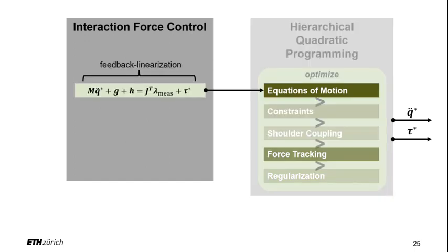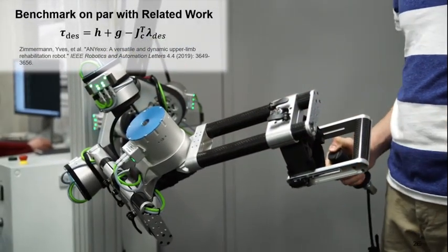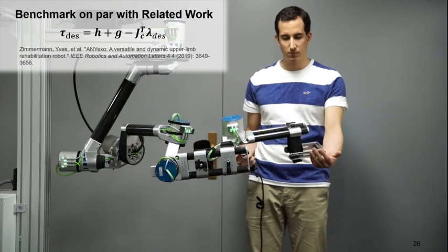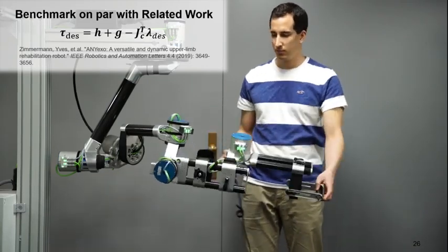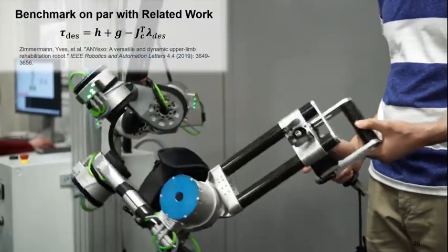To feedback linearize a closed loop system, we use a precise model of the robot and measurements of the interaction forces to the human. We could demonstrate that the speed for the compensation achieves on par performance with state-of-the-art closed loop systems in comparable robots. The advantage that was leveraged here is the precise torque control provided by our series elastic actuators.